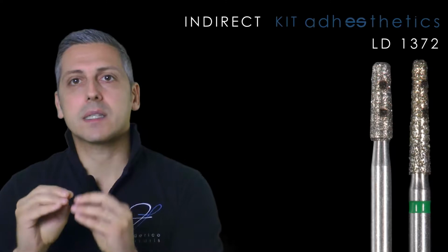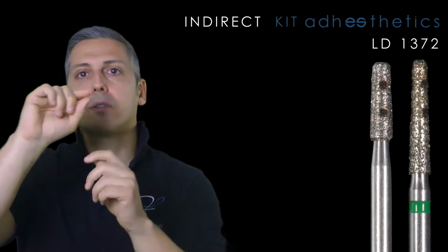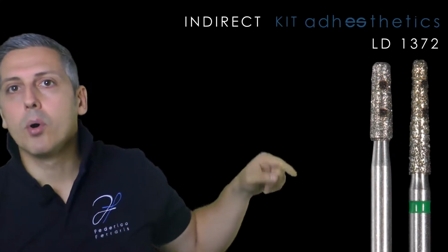But another thing they have in common, and today I want to talk about this concept, is the depth mark. The depth marks that you can find on these two tips are created like a drawing with a laser, and you can see black lines on both of these burrs. You can decide to work with these burrs in a vertical approach, in a vertical working axis. You can create a groove, and thanks to this you can create the depth of the preparation that you want to have, even if it's an indirect restoration like an onlay, or like the incisal edge you want to reduce for a crown or for a laminate, or even a crown in the posterior.